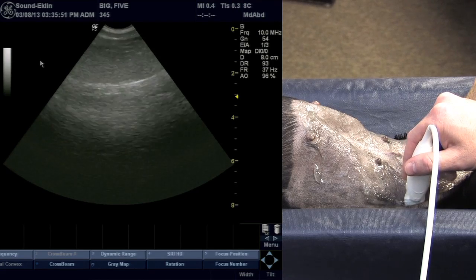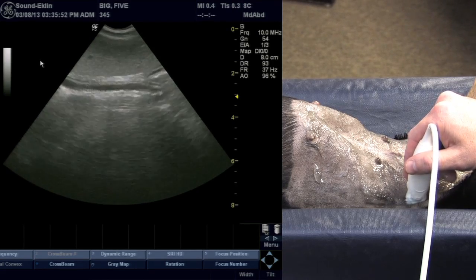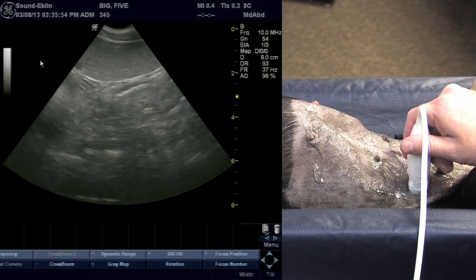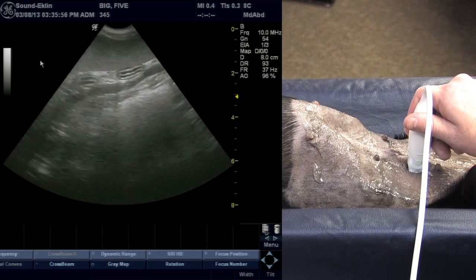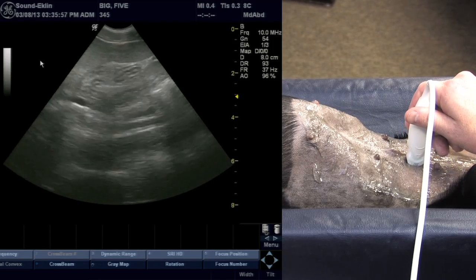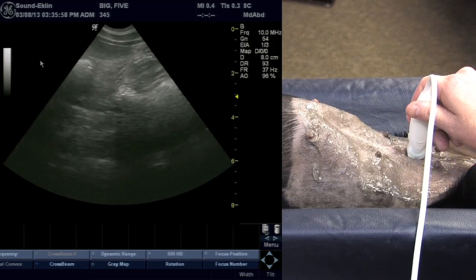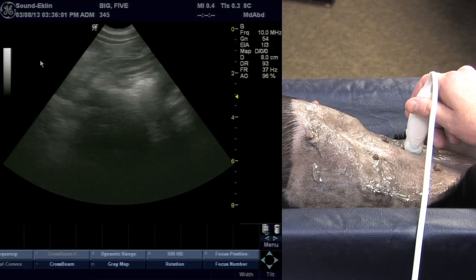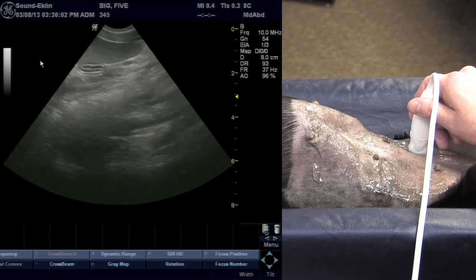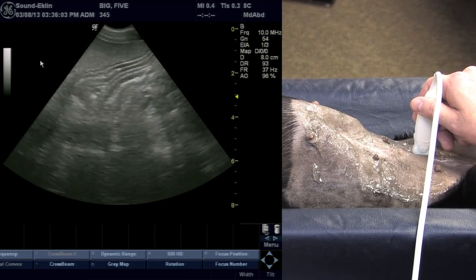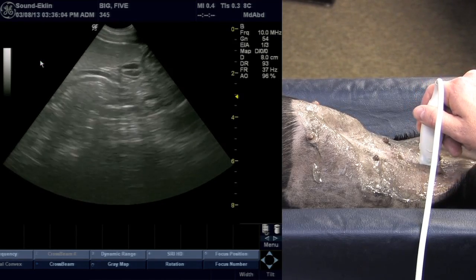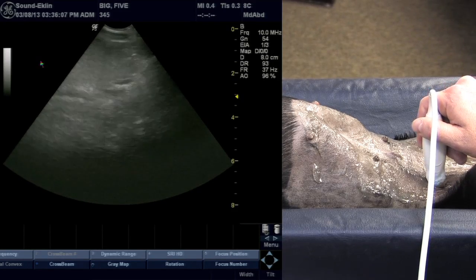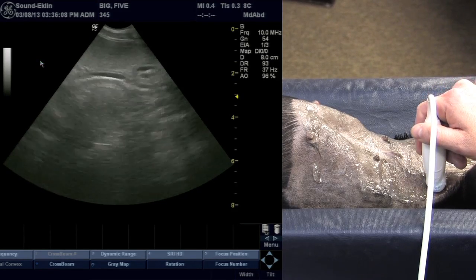At this point I'm going to slide just a little bit caudal and repeat that motion towards the left body wall, evaluating a slightly different portion of the spleen. I continue to do that until I feel like I have seen all of the splenic parenchyma that I can evaluate.